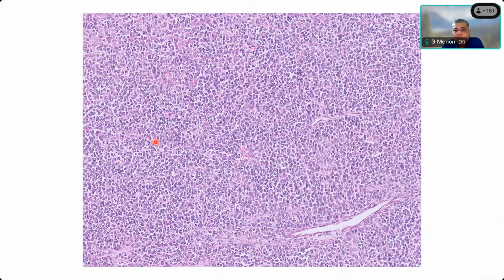How does the tumor look? Can anybody describe this? Shweta, can you describe this tumor? So, monomorphic type. Richa says it is a non-Hodgkin lymphoma. Very good, Richa. But before you diagnose, please describe the tumor. It's important at your stage to describe it. Is there a papillary pattern? Is it looking epithelial? Is it a sheeting pattern? Is there a nested pattern? Is it trabecular, or cord-like?